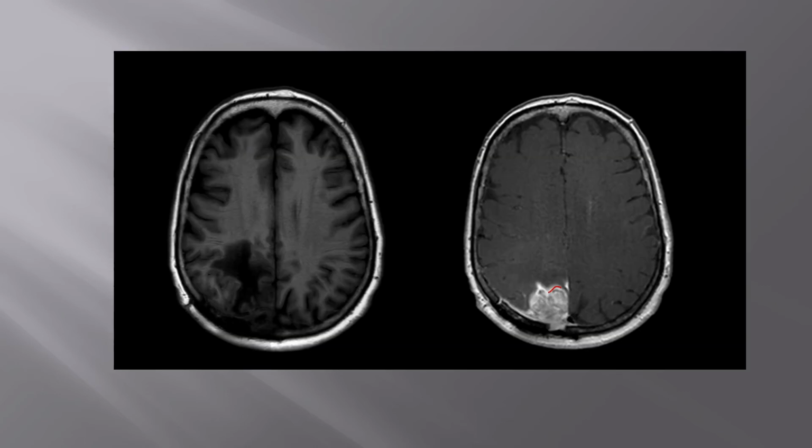Contrast, now this is kind of concerning. If there's necrosis, you would expect to see more irregular enhancement. This is pretty solid looking enhancement, so right away, pretty high concern that it's solid recurrent tumor.